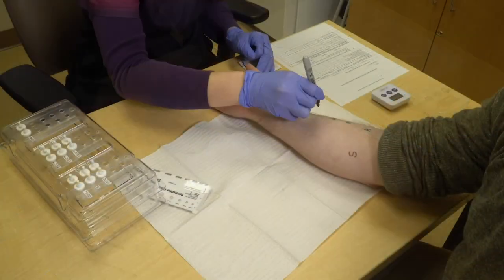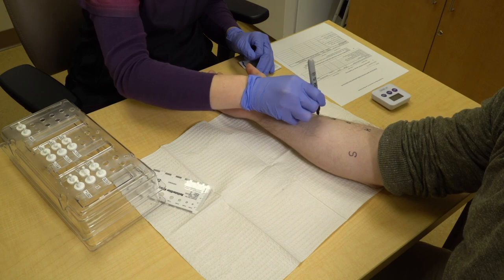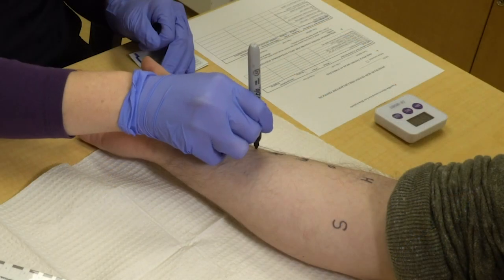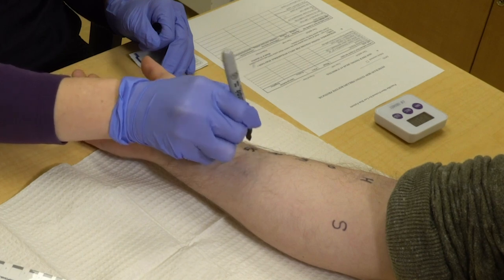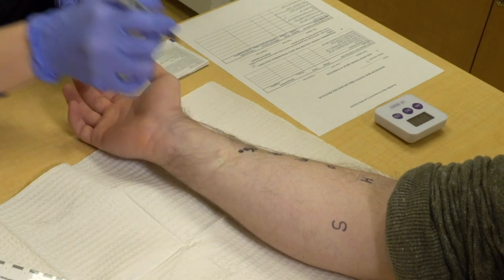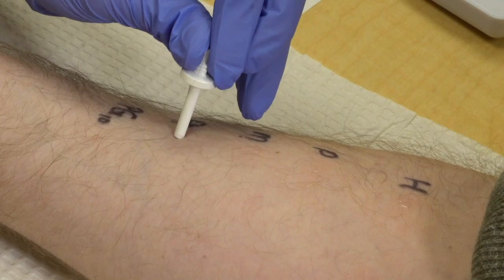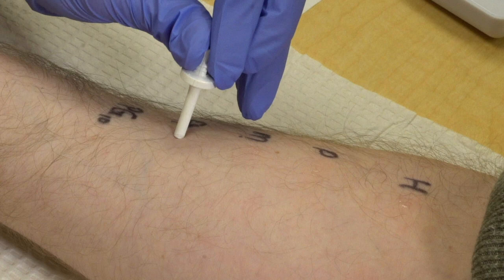Now let's turn our attention to skin testing. The first step is the epicutaneous or skin prick test. Use an alcohol swab to clean the skin, and once the alcohol has dried, use a permanent marker to mark where each reagent will be placed. Because most negative tests are going to be completely invisible, the markings help you remember where you put the skin test.